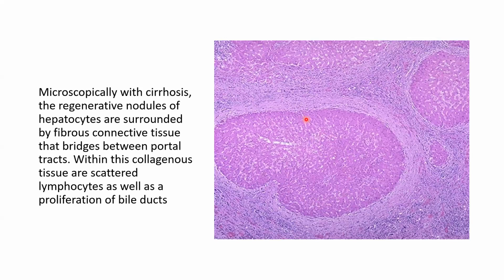This is the microscopic appearance of liver cirrhosis. I think this is the regenerative nodule in the middle, and on the periphery there is fibrotic tissue, fibrosis encircling the regenerative nodules. This we call cirrhosis. When the fibrosis forms a complete nodule, this is cirrhosis. In the background you can see a lymphocytic infiltrate. Once cirrhosis is established, it is difficult to know the etiological factor on histology. We can do serology, for example, and the patient may turn out to be hepatitis C virus positive.